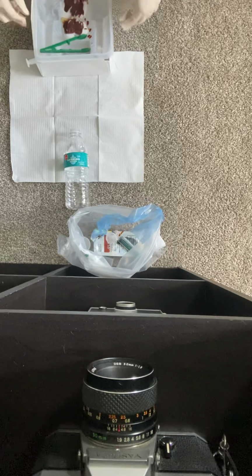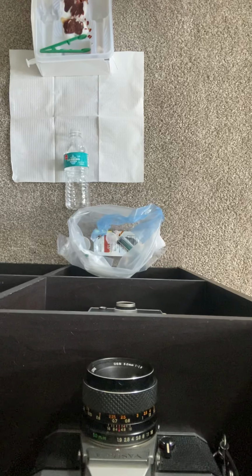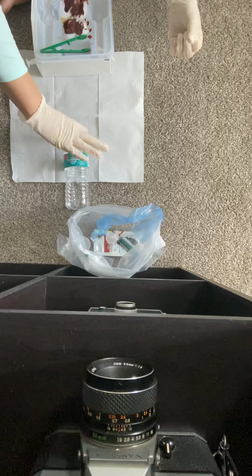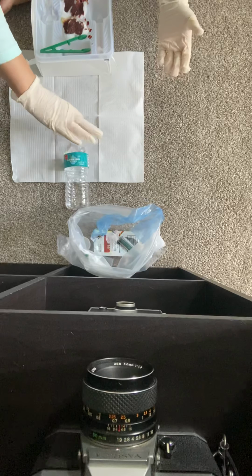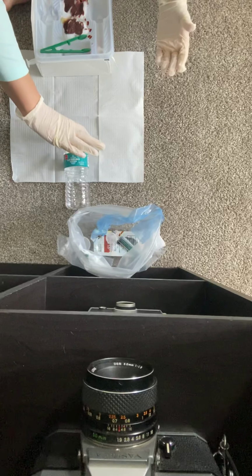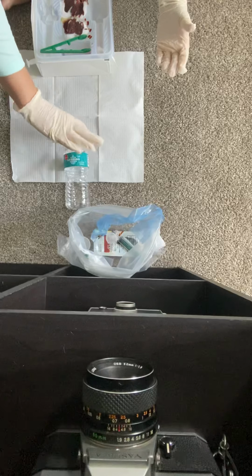So what I'm going to do is take my non-dominant hand. I am left-handed, so I'm going to take my right hand and spread the labia back. I hope it's not too hard for you to see, but I don't really have a labia to spread. So I'm just going to spread this back, and the meatus is going to be exposed here.